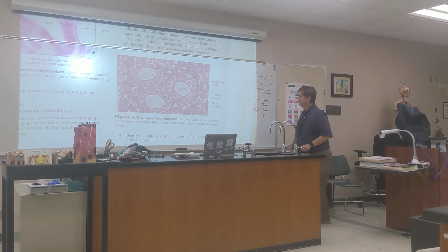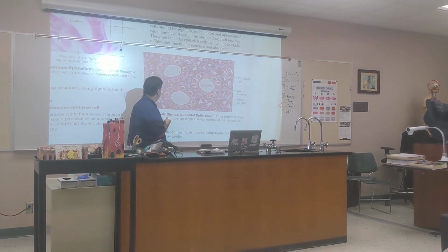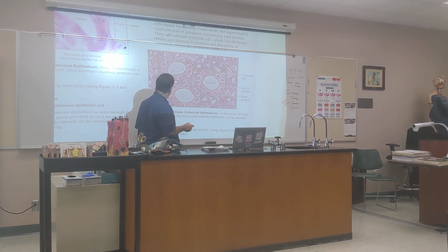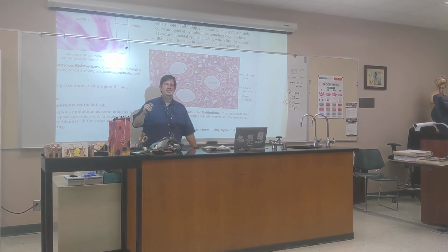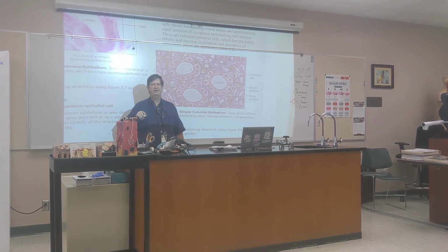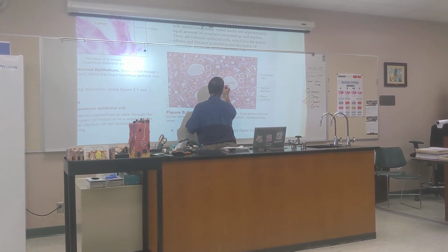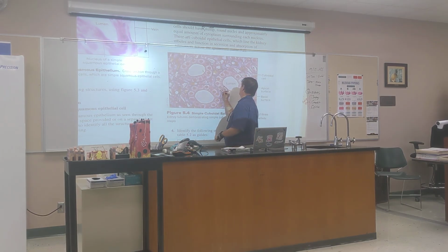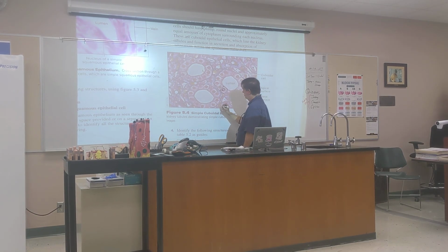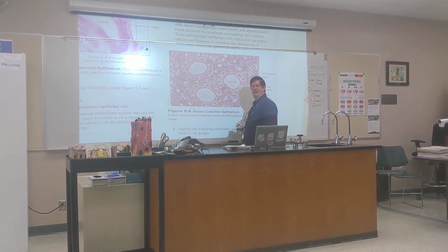All right. Simple cuboidal is one of those things you can mess up very easily, because more than any of the other tissues, this is a use-your-imagination tissue when we tell you it's cuboidal. Let me explain. There are some that very much resemble a cube, and they have a nice big round nucleus. But there are some that are very much imagination to call a cube.